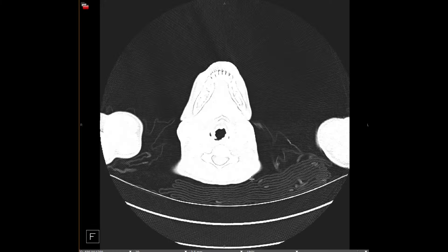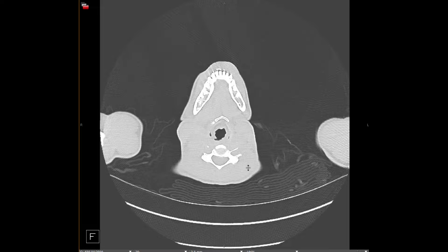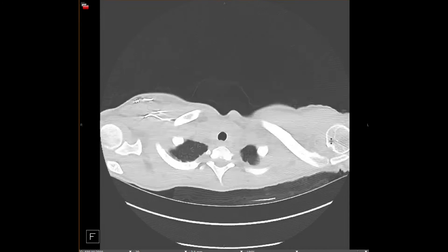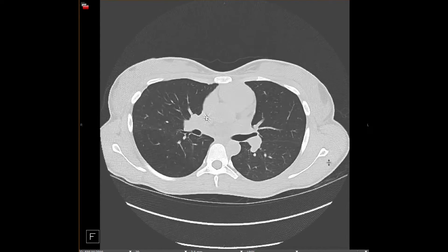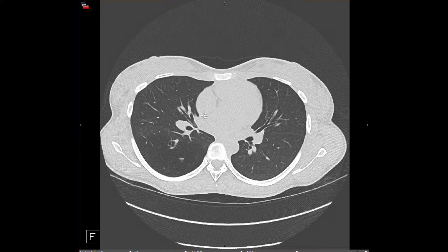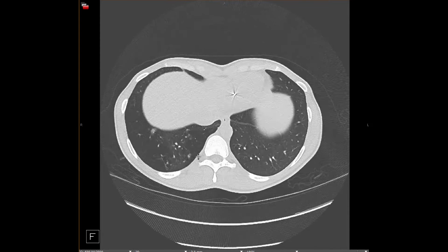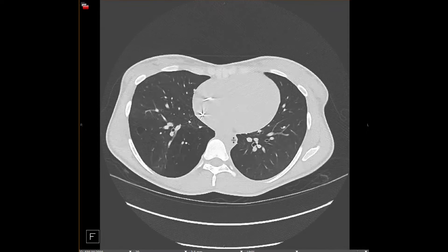Bronchial atresia is thought to occur because there is some sort of obstruction of a bronchus within the lung that no longer communicates with the bronchial tree. It's believed to be some sort of congenital or very early insult, potentially vascular. What happens is that the distal lung has air trapping because air can get in through collateral ventilation but cannot get out. Here we can see in the right lower lobe a large area of hyperinflated lung with decreased vascular markings and decreased density.